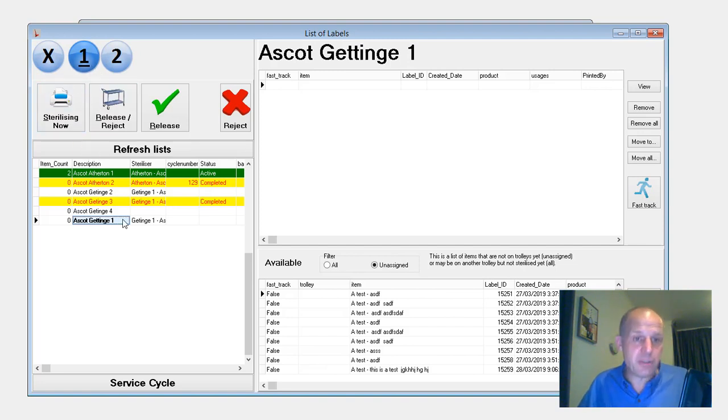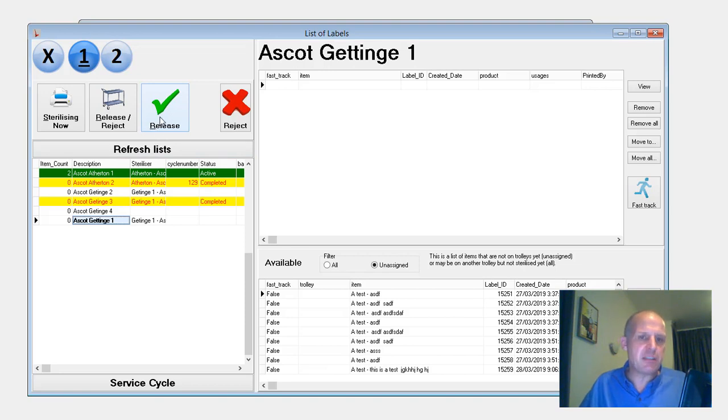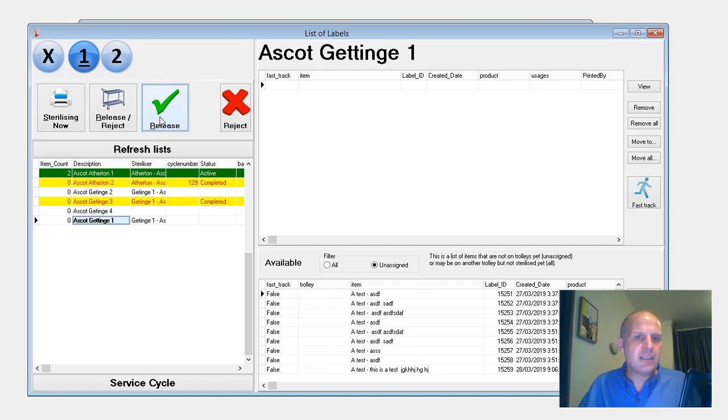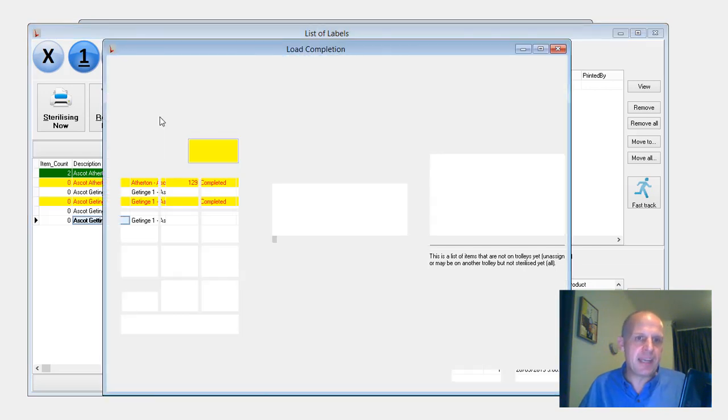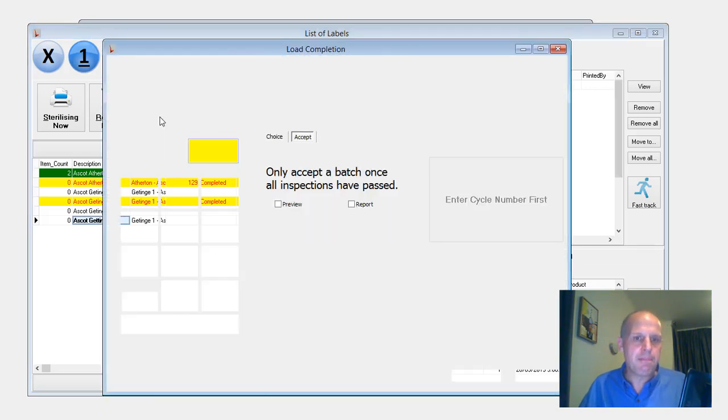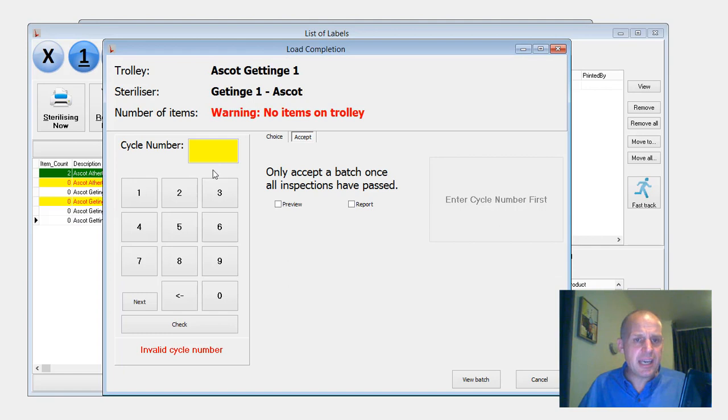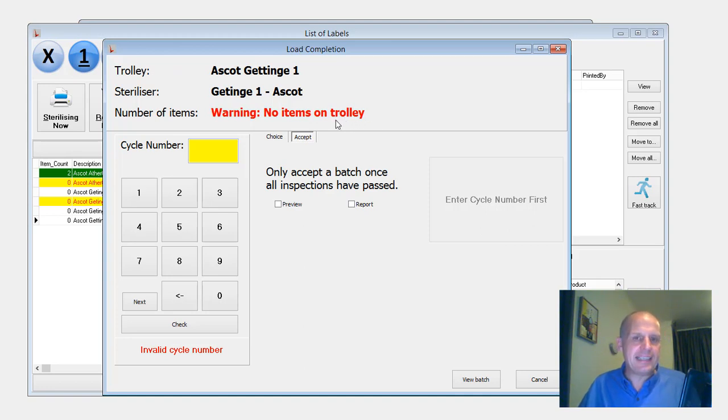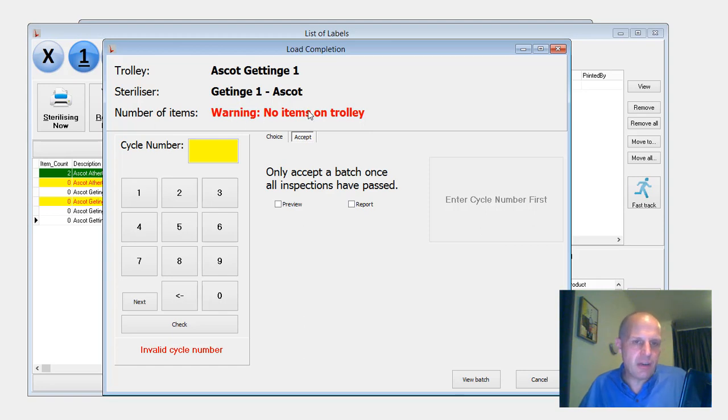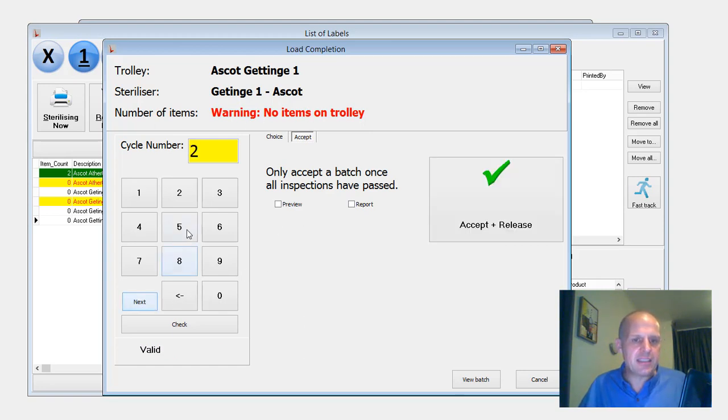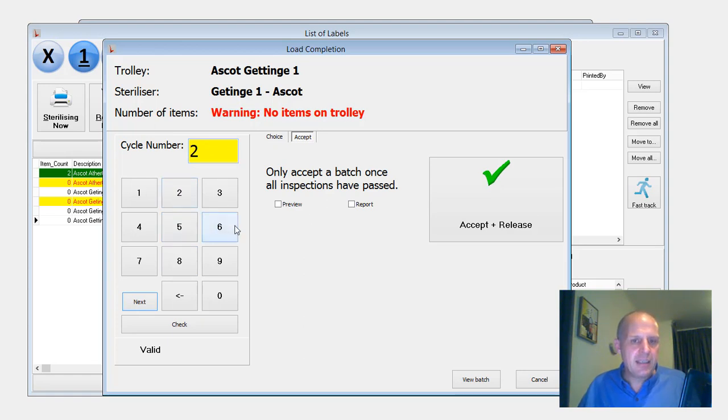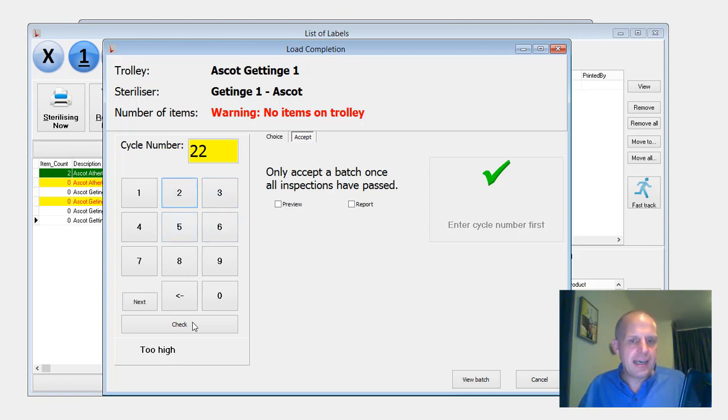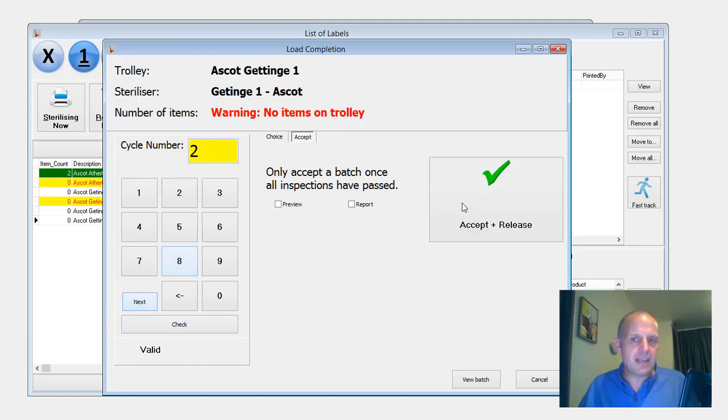At the end of the procedure, now what we do is we have a release button. And basically what my goal was was to strip away all the gumpf that people weren't using. And so you come in here and it's saying it's this trolley, it's in this steriliser. It's given me a warning that I haven't actually scanned anything onto that trolley, but normally it should say, you know, total 10 items or whatever. If I click next, it will tell me the next cycle number for that steriliser. And if I was to type in something, it would do a check and it's saying it's too high. So I'll go back to two and then I press accept and release and that's it.